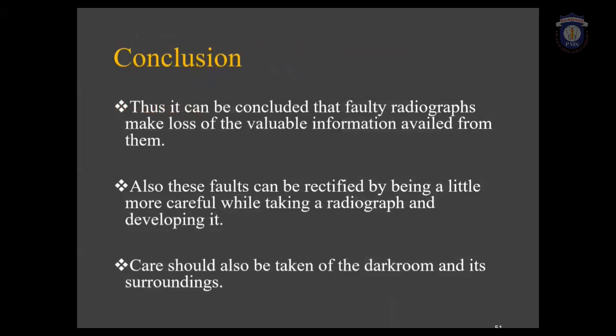Therefore, we can conclude that faulty radiographs cause loss of the valuable information that can be availed from them. Also, these faults can be rectified by being a little more careful while taking a radiograph, developing and fixing it. Care should be taken of the dark room and its surroundings.